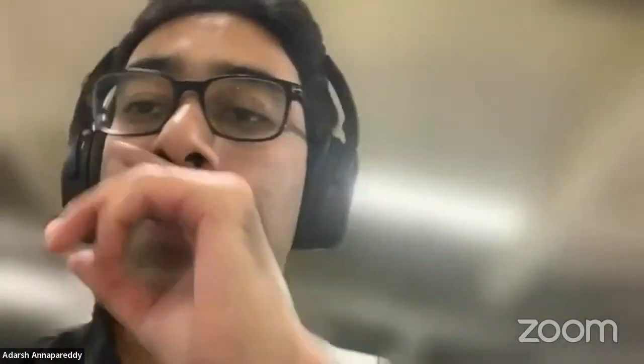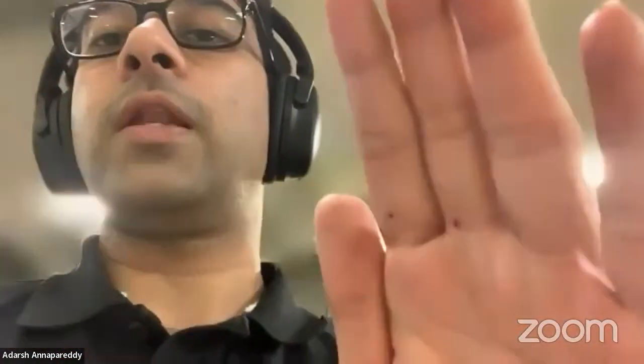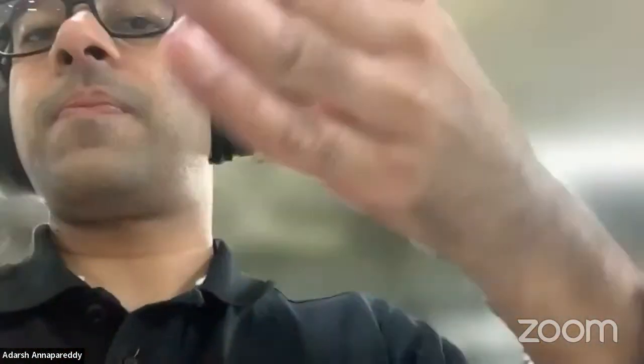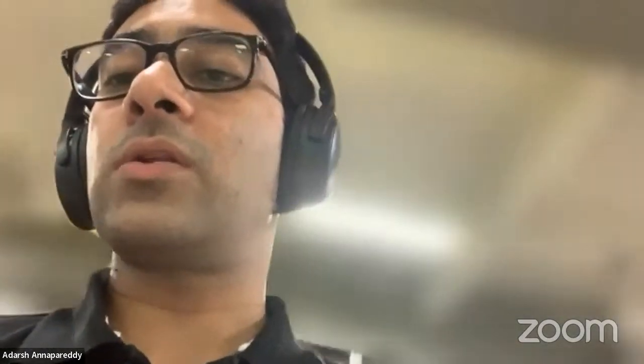For the conventional unis, the most important step is your vertical cut. That's where you have to be the most careful. Everything else will go fine. It's just that cut which is the difficult part because you don't have a jig. And the moment you go down, you see how much the stress riser comes. So if you can be very, very cautious in that step, 90% of your case is done and the rest of it goes very smoothly, like a symphony. I used to do my Oxford unis in about 25 minutes, skin to skin. So just have to be careful at that step, especially.